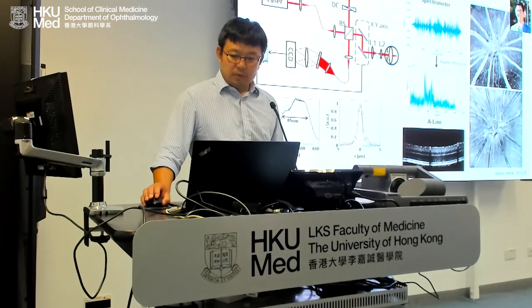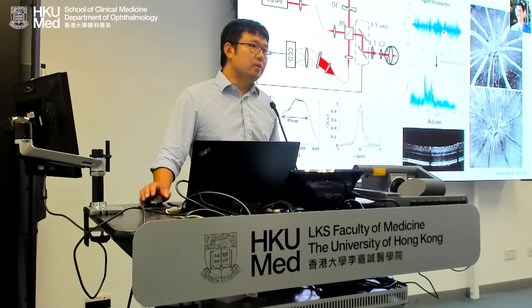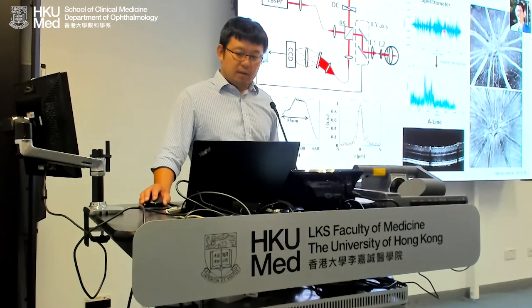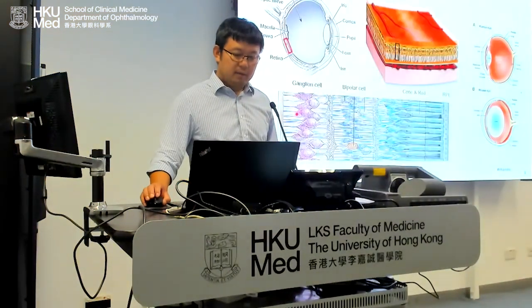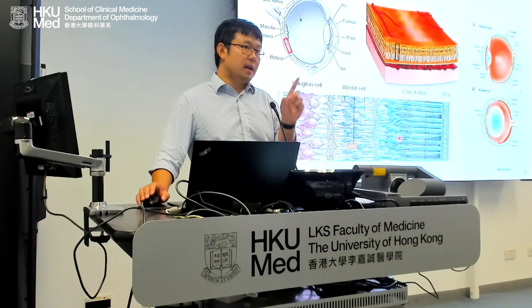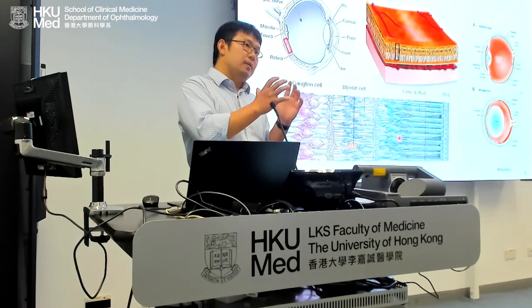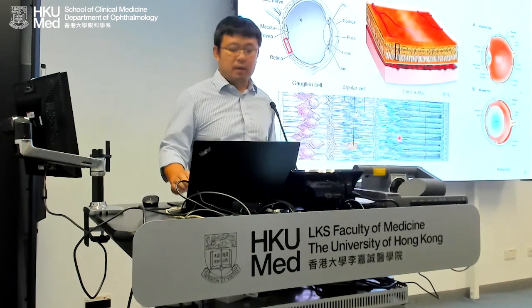This signal looks like a random signal. So this is a spectrometer signal. What does OCT do? OCT sends a beam of light to the eye, and the different layers of the cells reflect the light back to the detector. Because the light is reflected at different depths, OCT builds an interferometer to detect the path difference and to reconstruct the image.